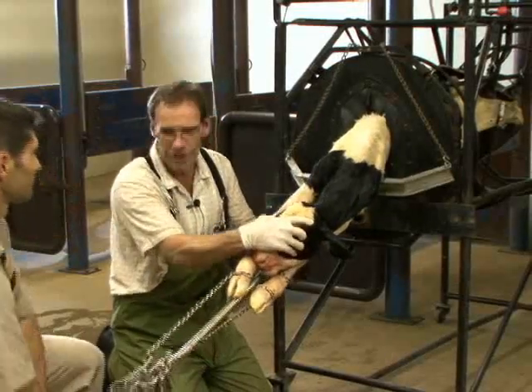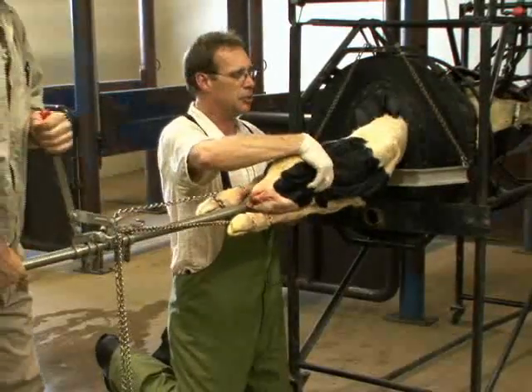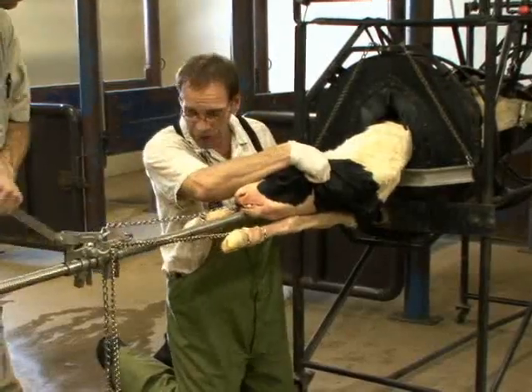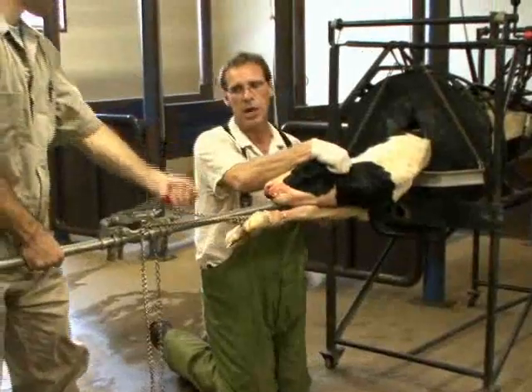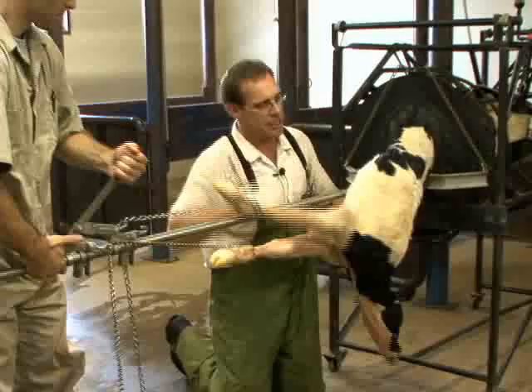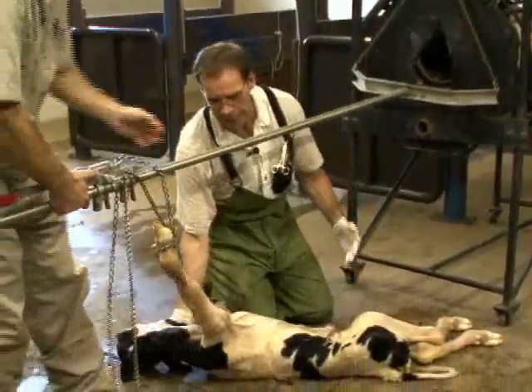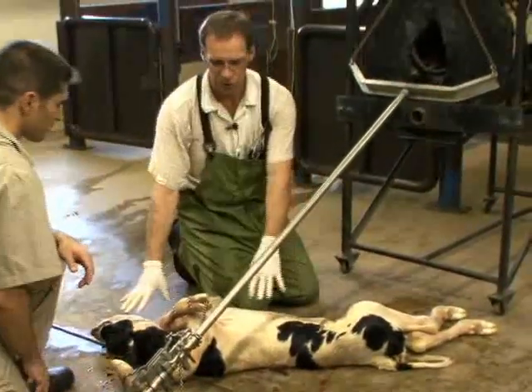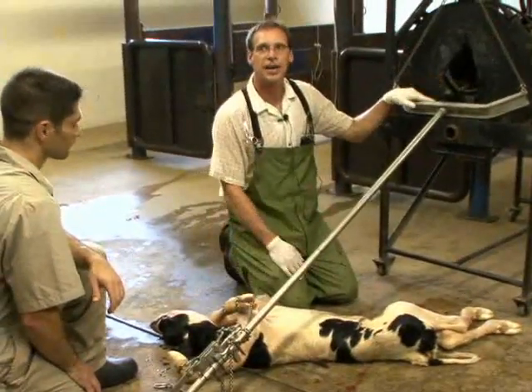We lift up again and this can go very quickly now. We can rotate the calf a little bit so that the hip diameter aligns with the lengthy part of the pelvic entry. We take the end down again to bring more calf out, then crank a few more times — we have a lot of pull here to work with. We continue until we catch the calf and it is delivered completely out of the cow. We can drop everything down, then make sure to pay attention to the calf to ensure it breathes, and also pay attention to the cow after delivery.